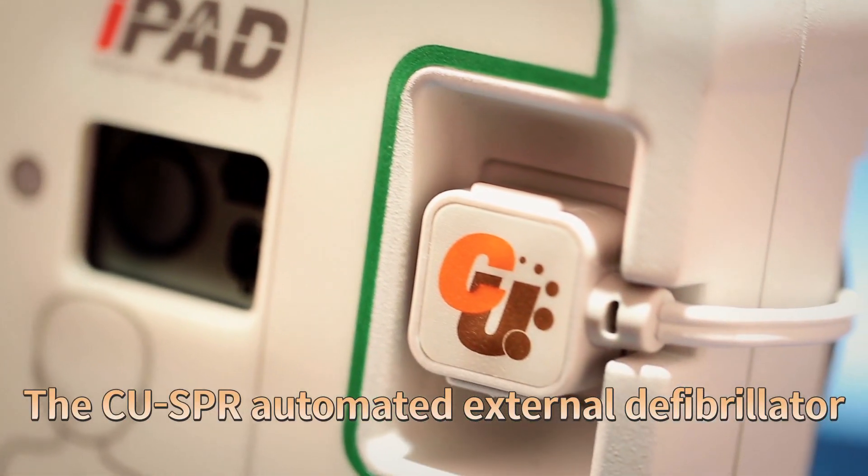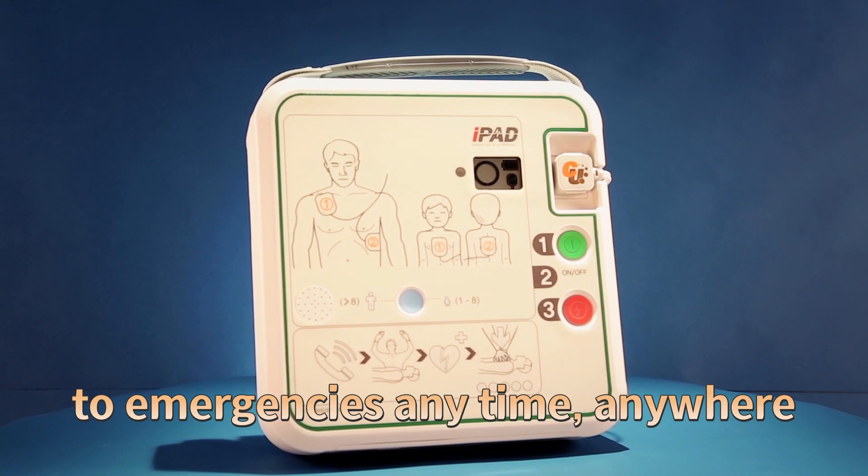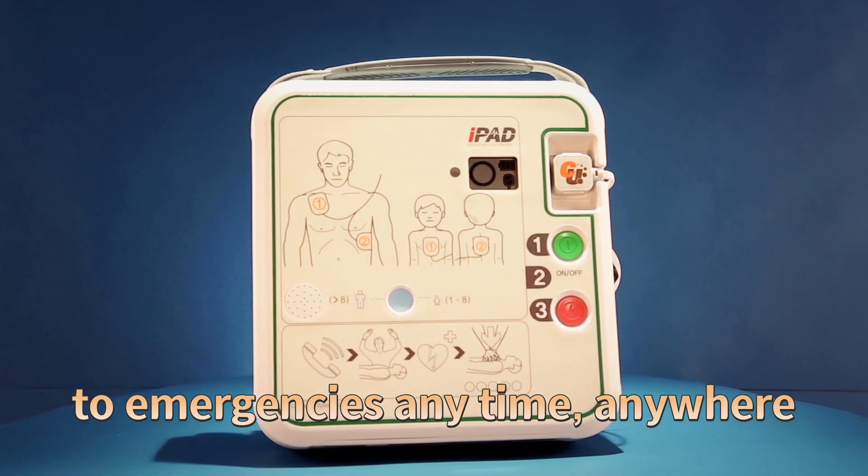Anytime, anywhere, anyone can quickly respond to an emergency with the CUSPR Automated External Defibrillator.